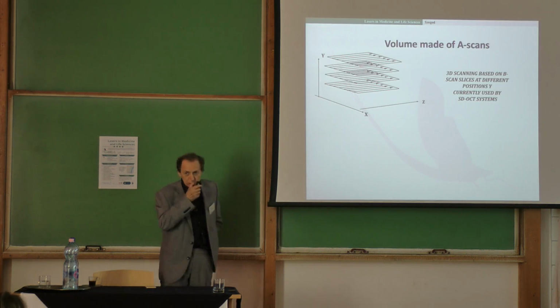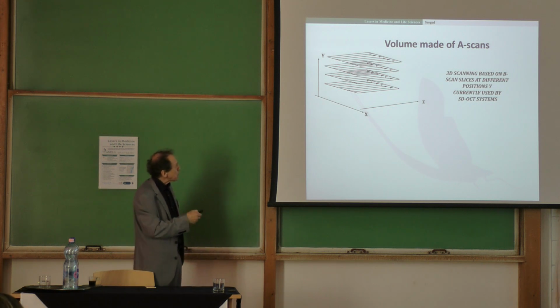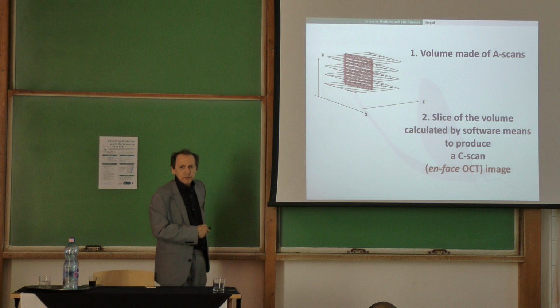Let me take you to the modern technology. In the modern technology, we now operate faster on the scans, and we build the volume of the scans, and then cut the volume and produce an en face image. That's the way the modern technology is produced.